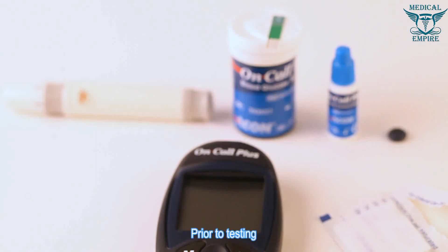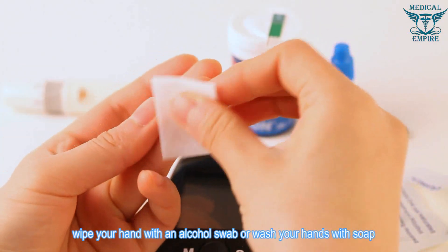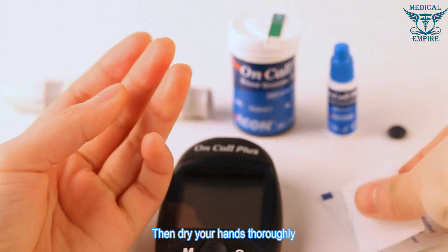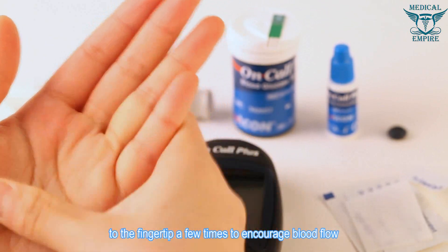Prior to testing, wipe your hand with an alcohol swab or wash your hands with soap, then dry your hands thoroughly. Massage the hand from the wrist up to the fingertip a few times to encourage blood flow.